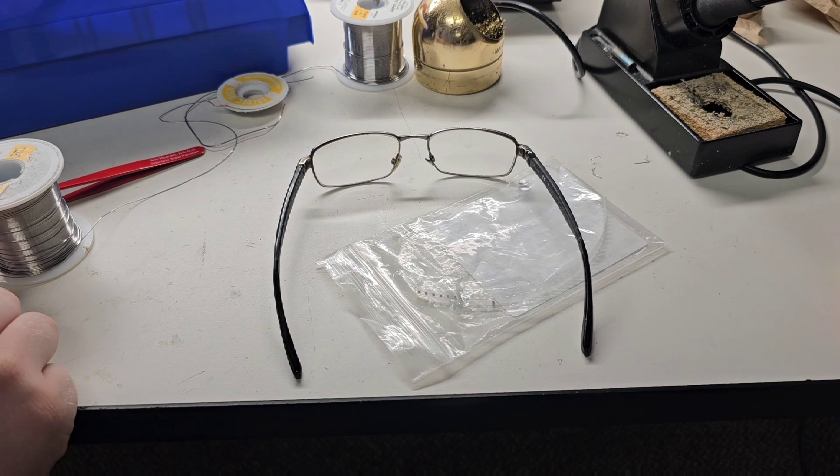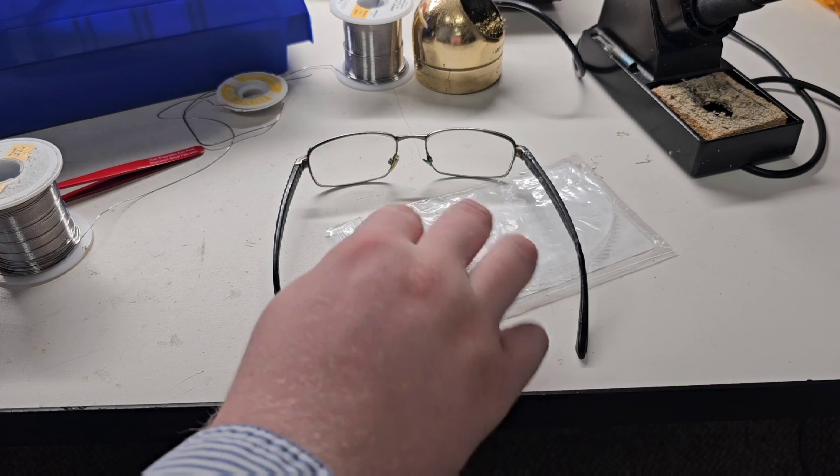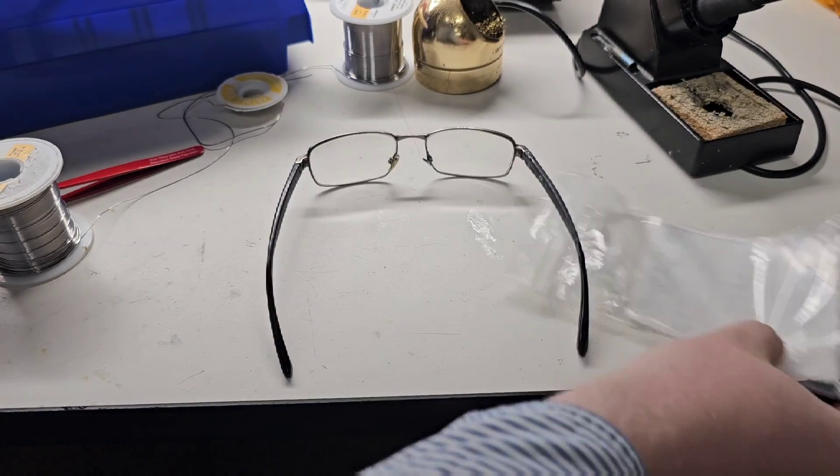Let's let that set up and then we'll get into the actual repair of the glasses. Now that it's cured, let's get this out of the way.